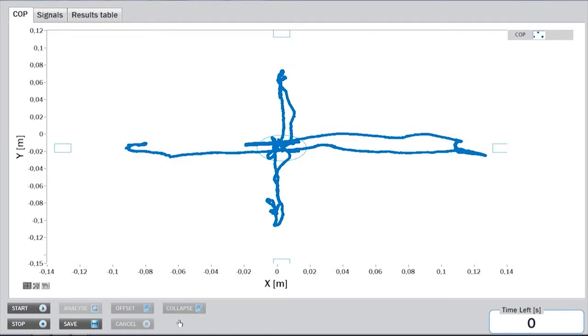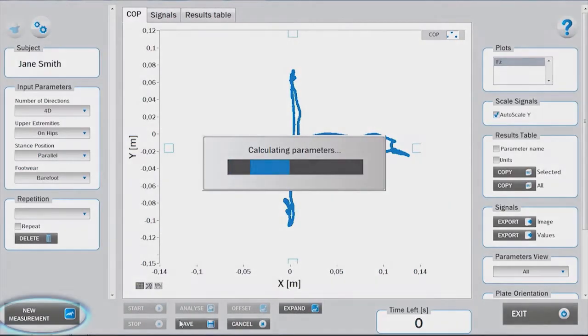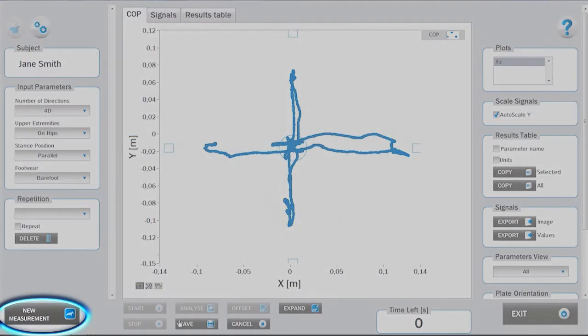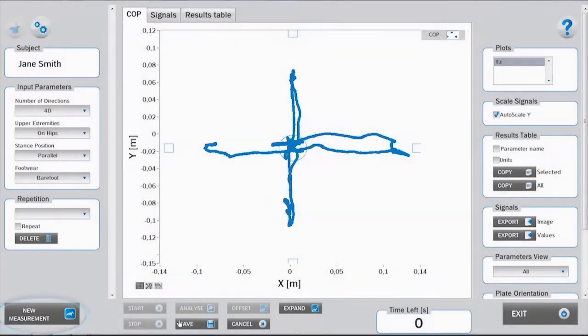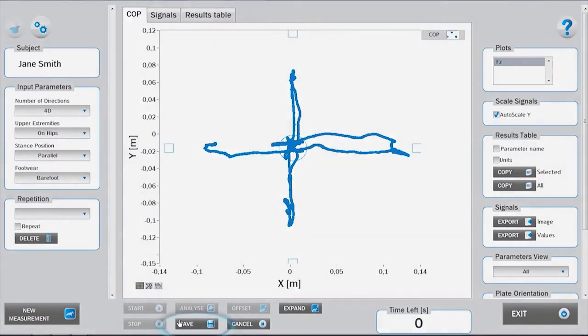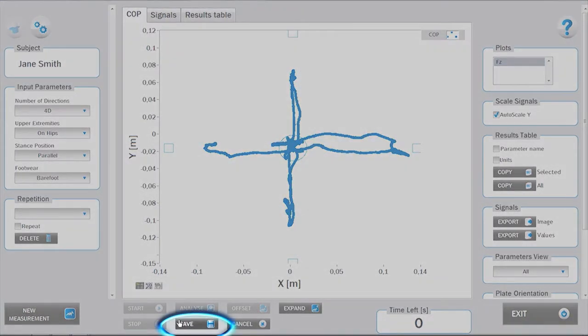The measurement can be repeated by clicking New Measurement, thus not saving the previous repetition. If you are satisfied with the measurement, you can save it.